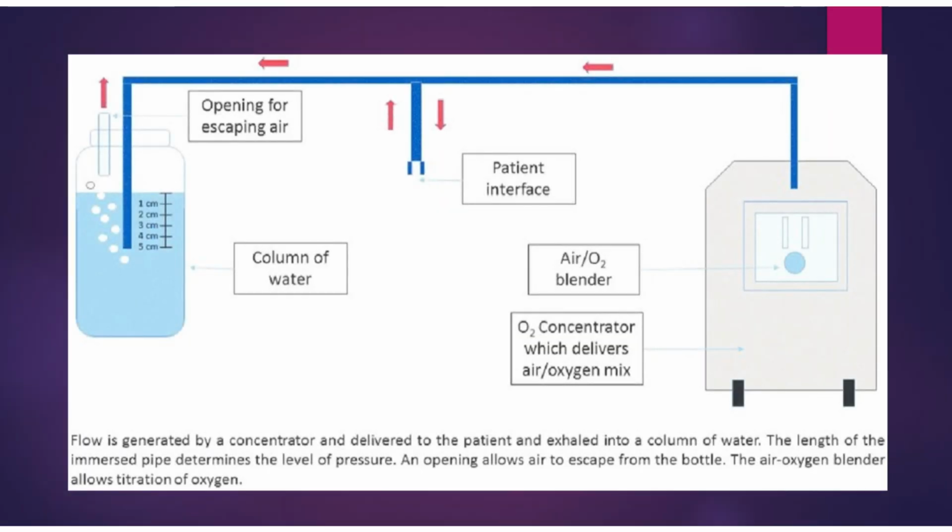So the pressure, maybe we have the diagram. The pressure is different. I think the way we do this in Mbale is we think simply. We try and do everything simply. On Martha's slide there, you've got the oxygen source on the right, and the pressure source on the left. From a very simple point of view, and it seems to work for us, the oxygen source, we titrate it against the baby.